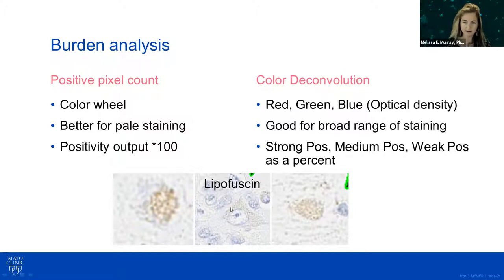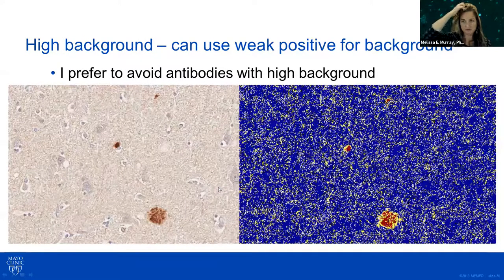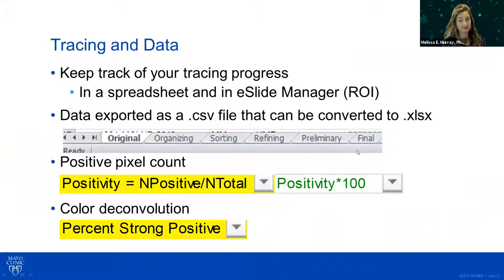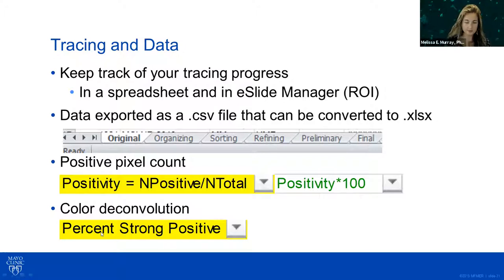I like color deconvolution when there's a broad range of staining — it uses red, green, and blue components; it's based upon optical density. You can adjust accordingly and use different levels to your advantage, for example setting weak positive as your background. I keep in mind lipofuscin — I go above approximately 185. The results can be exported as a CSV file convertible to Excel. With color deconvolution it automatically comes out as percent, so you don't have to multiply.